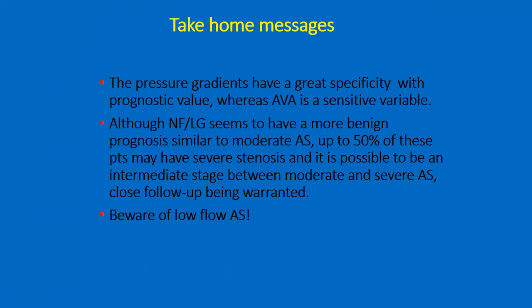sensitive variable. Although normal flow low gradient seems to have a more benign prognosis similar to moderate AS, up to 50% of these patients may have severe stenosis, and it's possible to be an intermediate stage between moderate and severe aortic stenosis, close follow-up being warranted. And finally, be aware of low flow aortic stenosis.